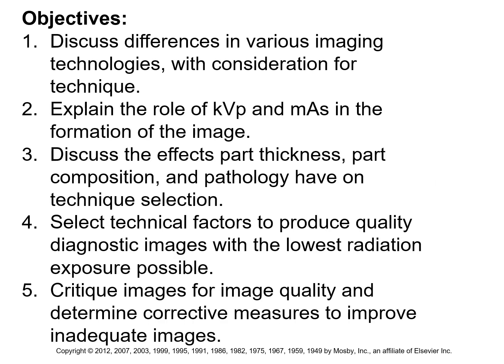Okay. Now, we're not going to dive deep, so if you jump into Bouchon and start reading and getting confused, maybe understand that this is just an introduction. We're just kind of skimming the surface and the big picture ideas. The deep dive is, again, Mr. Shepard next summer, okay? So I'm going to talk about various imaging technologies, and really it's a difference in image receptors. The X-ray tube has basically been in its current form since I would say the late 1930s, right? That's the last significant technological innovation to the actual X-ray tube itself.